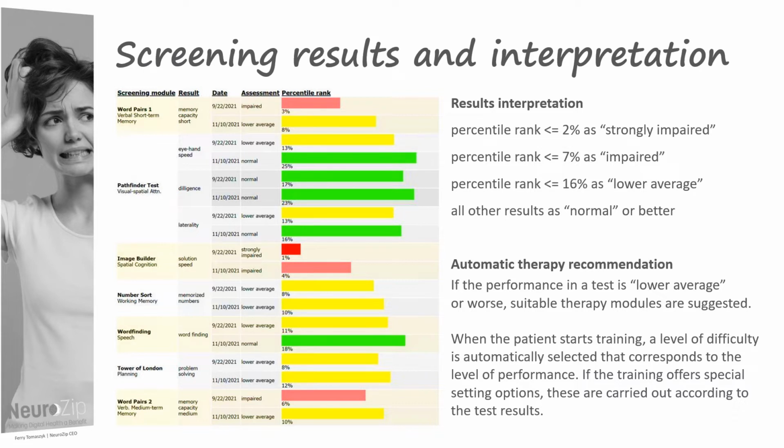There are 3 parallel variants for each test. Nevertheless, and in accordance with the test theory, an appropriate time should have passed between the tests in order to avoid learning effects. Therefore, the screenings cannot be repeated for monitoring purposes sooner than after 4 weeks.